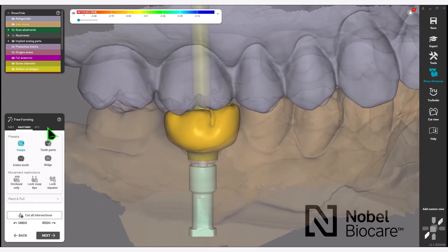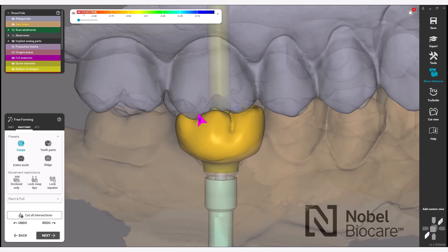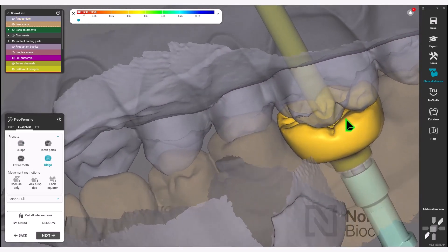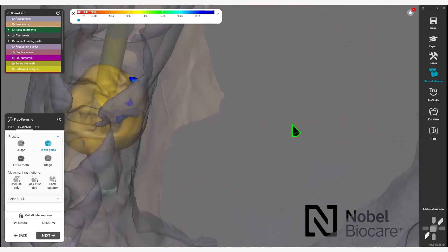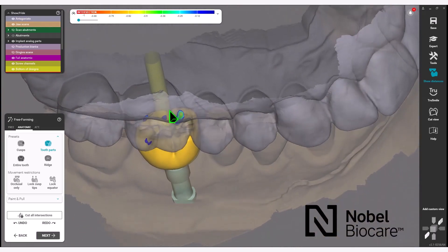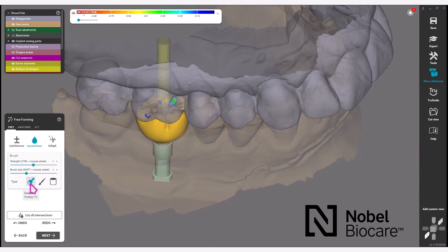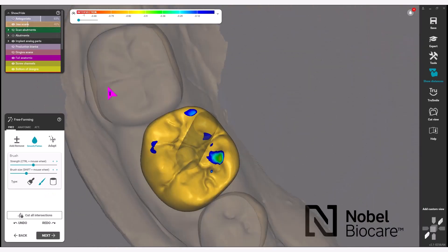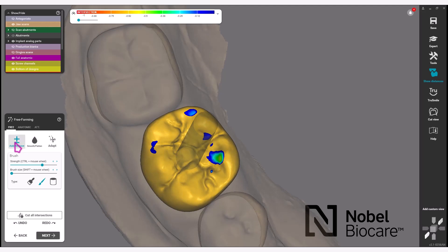Use the anatomic feature of the free-forming section to do more refinement. You will notice your contacts as you are adjusting your crown. Adjust the size of the brush, the strength, and the different types to design further anatomy. Use the tools as needed to adjust your crown.